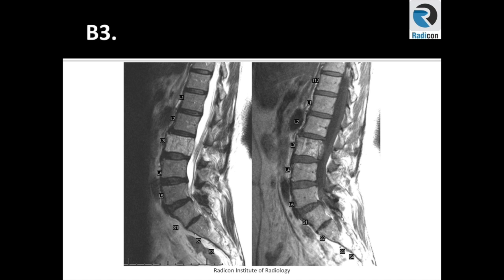This case shows sagittal images of a hemangioma in the L3 vertebral body. Typical appearances are high T1 and T2 signal intensity with enhancement in post-contrast sequences. Incidence is approximately 10%. Infrequently, these can turn symptomatic and cause neurological deficits such as cord compression through any of the four reported mechanisms: epidural extension, extension of the involved vertebrae causing spinal canal stenosis, spontaneous epidural hemorrhage, or pathological burst fractures.